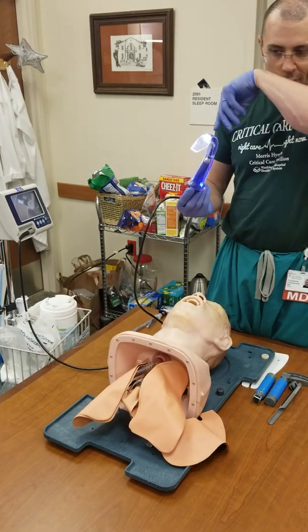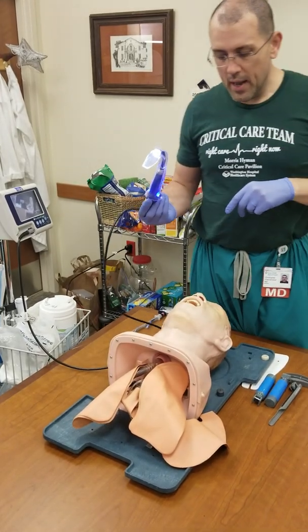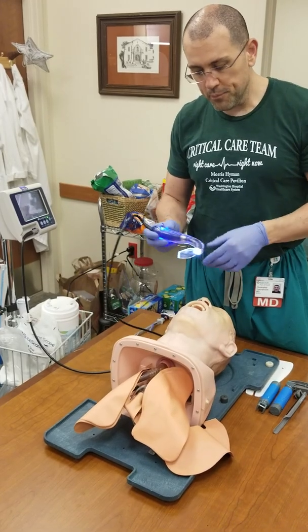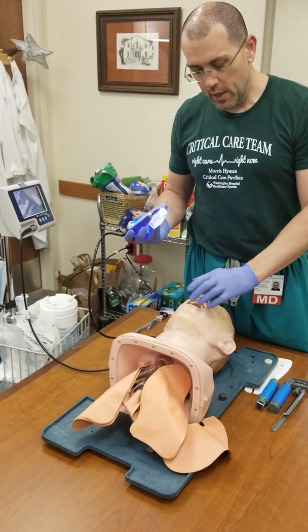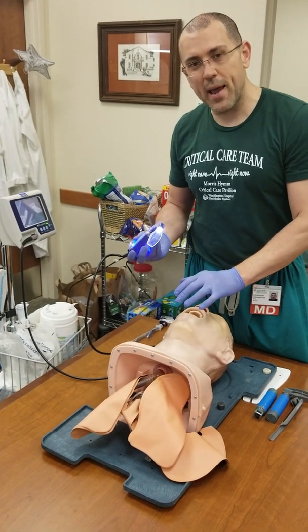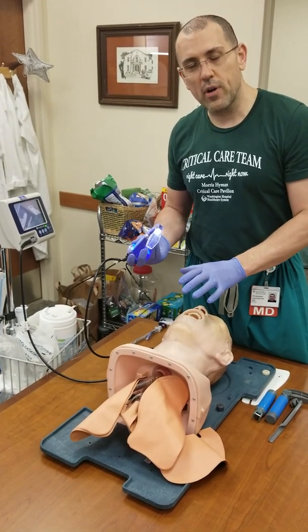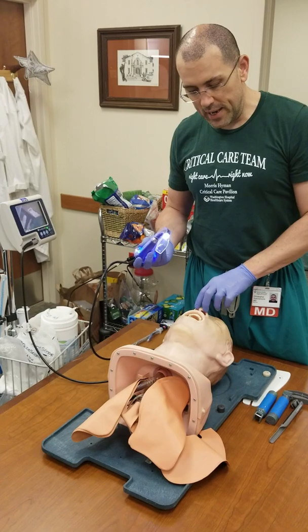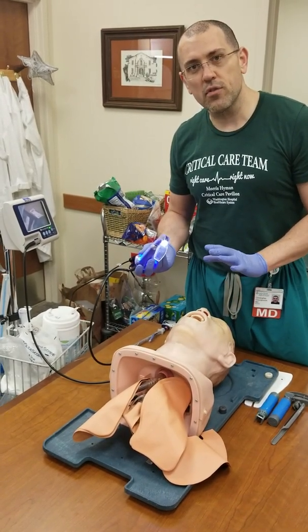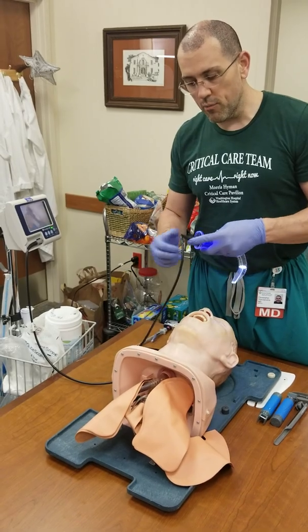Now we're going to start with the GlideScope. There are different ways to use each of these; I'm going to show you the best way. Here's our patient that we're now going to intubate. We've done our bag masking. The patient is pre-oxygenated and has a nasal cannula supplying supplemental O2, which prevents further desaturation and gives you more time to intubate.